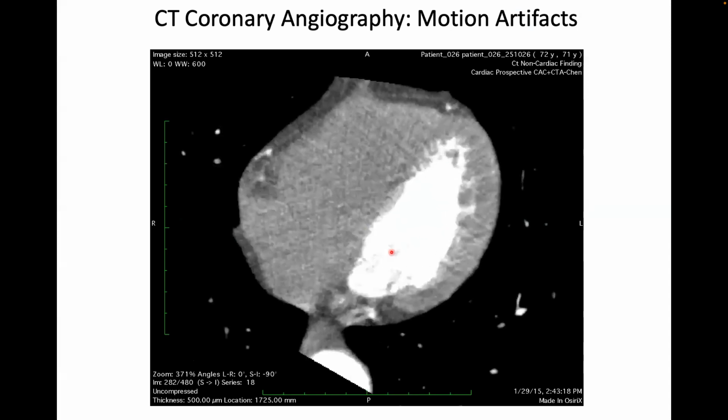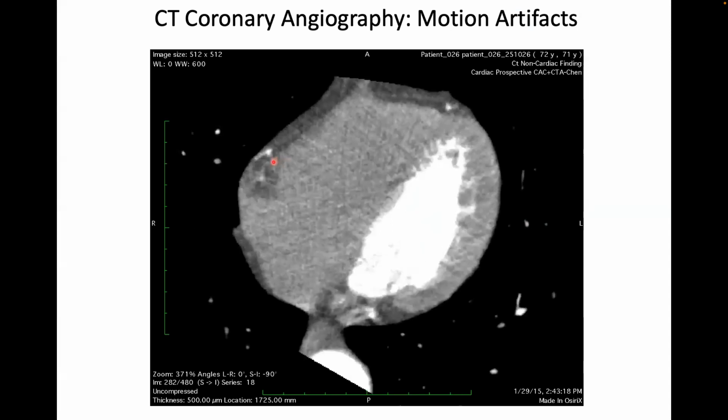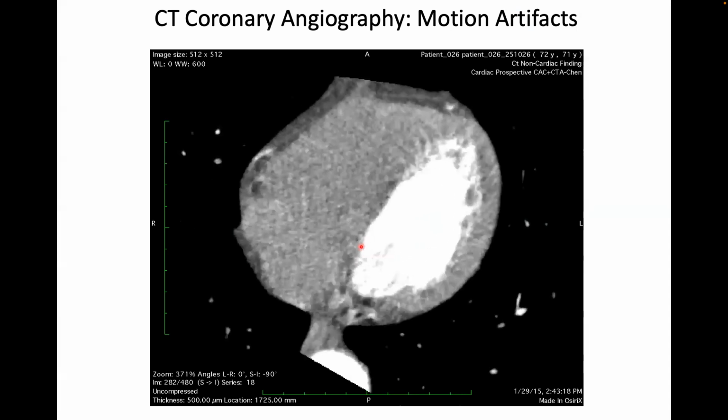That's end diastole, because you can see the heart relaxes and the blood fills into the left ventricle, and then it sits there for, say, 200 milliseconds, maybe 250, where you get a good picture. And then end systole is when the heart is contracted maximally, so the left ventricle is the smallest it's going to get. There's about a 50 millisecond window there where the heart's still, and so there's a lot of coherence in those vessels at that point, right?